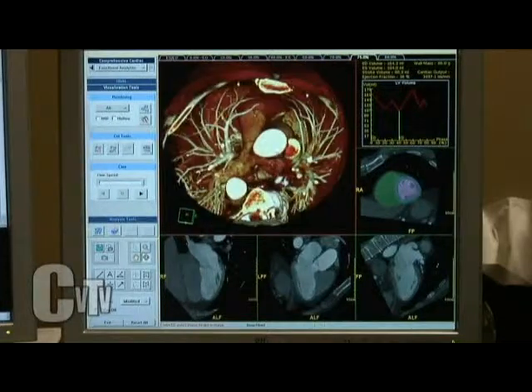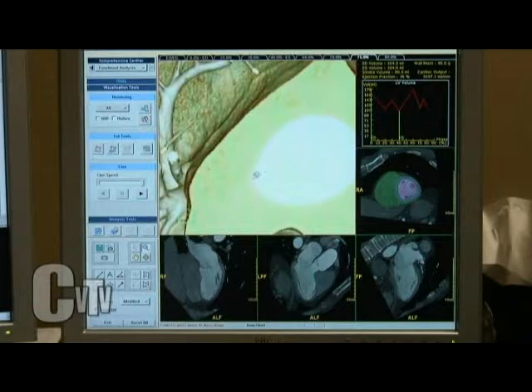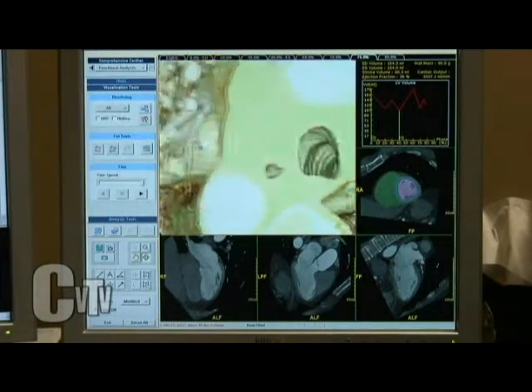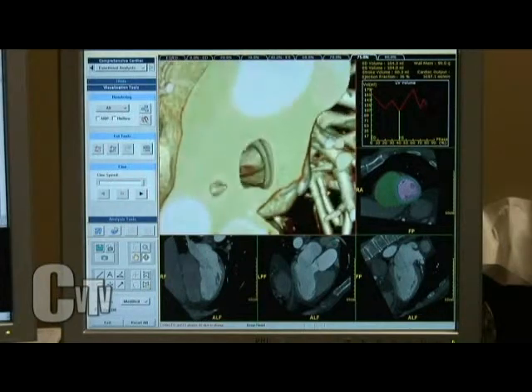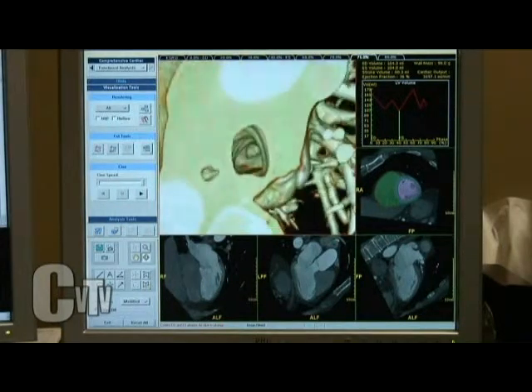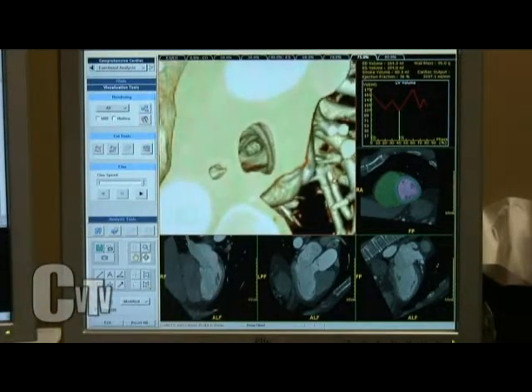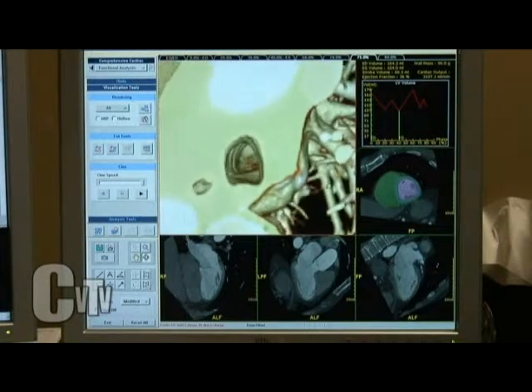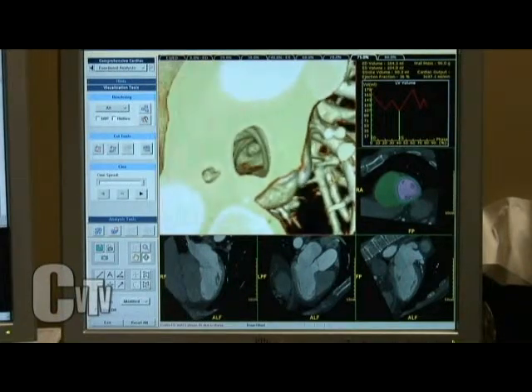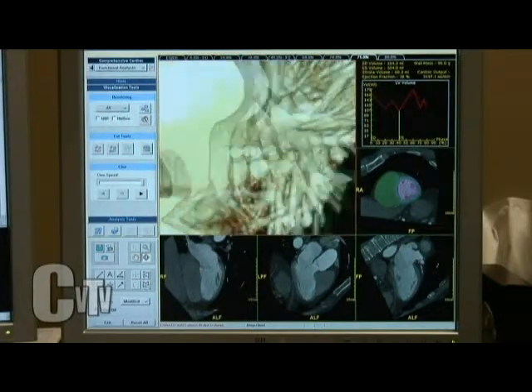And we can also take a look at the trachea. There's your windpipe, so we can take a peek right down your windpipe here. When we used to do this invasively, we called it a bronchoscopy, to look for tumors, cancers and masses. Now we can do it all virtually. So this is a virtual bronchoscopy, which we throw in there. And that looks good. No tumors, masses, cancers, no pennies, nickels, batteries, bubble gum.